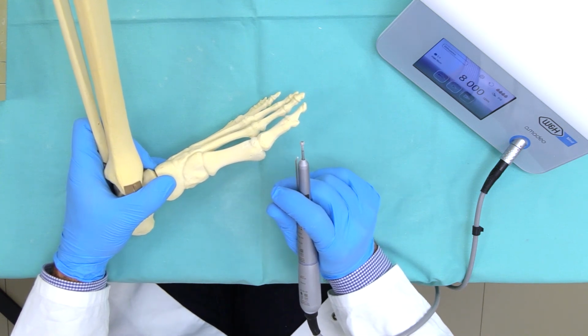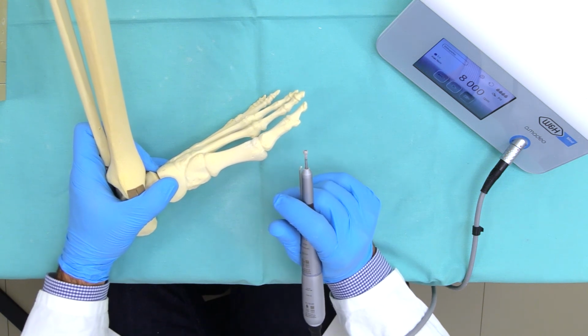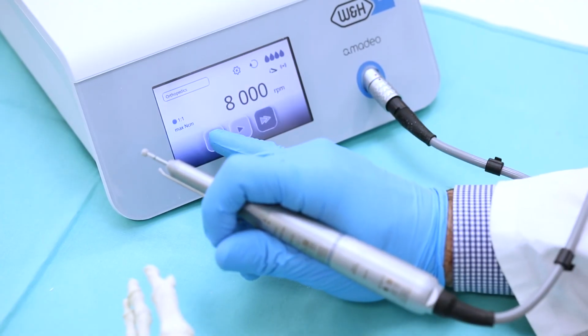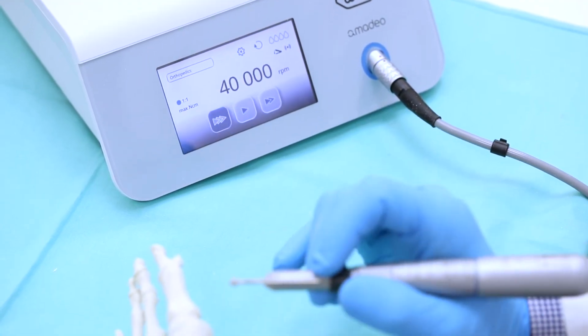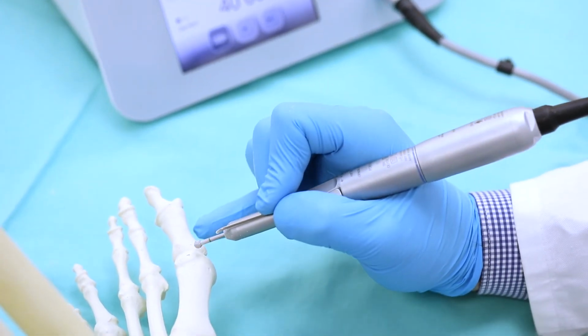We can also use 40,000 rounds per minute to remove larger exostoses. I normally use the foot control for doing these procedures.